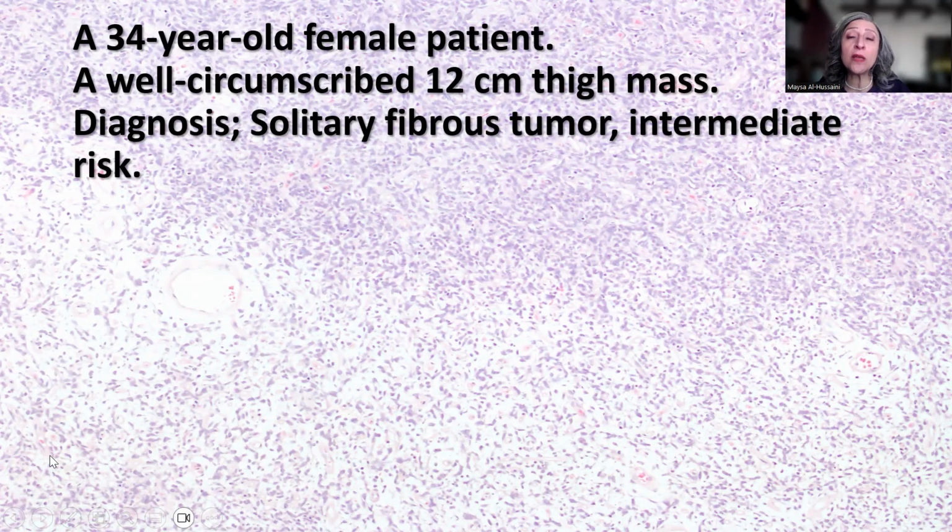Remember that the clues to the diagnosis are the hypo- and hypercellular areas. Remember that the tumor cell nuclei usually lack features of malignancy. They are usually monomorphous, with vesicular nuclei and inconspicuous nucleoli. Remember that myxoid changes and multinucleated tumor giant cells can be part of the tumor. Remember that hyalinization of the vessels is an excellent clue to the long-standing feature of the tumor and thus, in a way, to the malignant potential of the tumor.